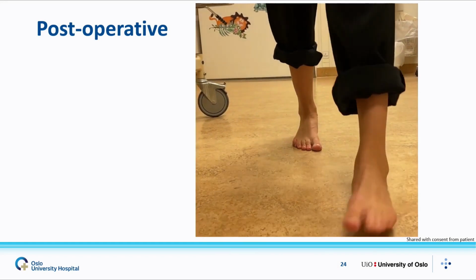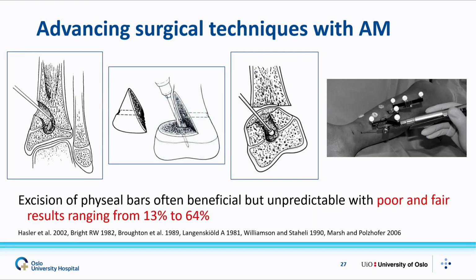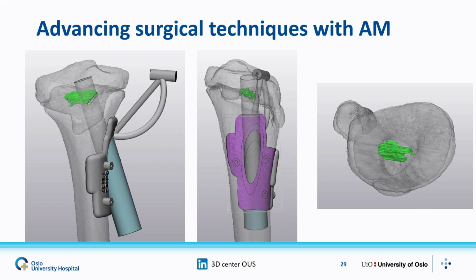Another strength is that we can develop totally new surgery techniques. This is a case of a 12-year-old girl. She got a fracture and she got a bony bridge in her growth plate, meaning this growth plate is going to stop giving her growth. Ordinary techniques have been described to remove those bony bridges and bring growth back again, but they have an extremely high failure rate and involve very extensive surgery, if you look at those pictures. So what we did is that we segmented this case and we could depict exactly the bony bridge in the growth plate. And then, by 3D planning, we created a guide for how to remove exactly this portion without hurting the rest, the residual growth plate.